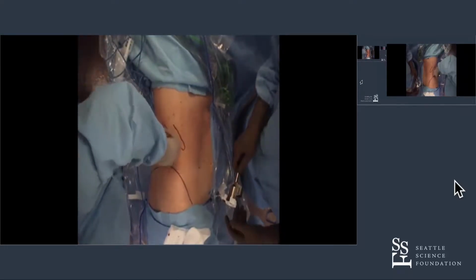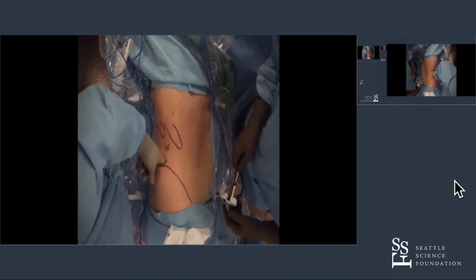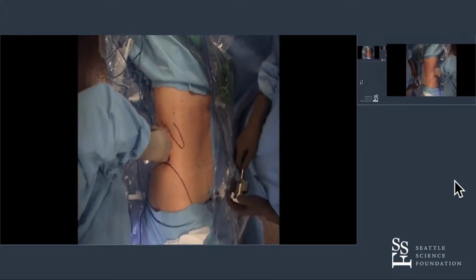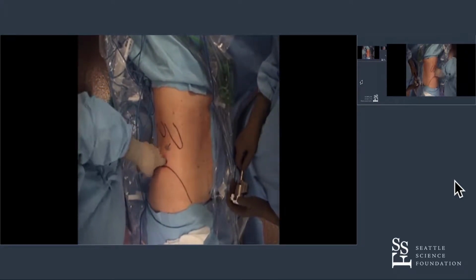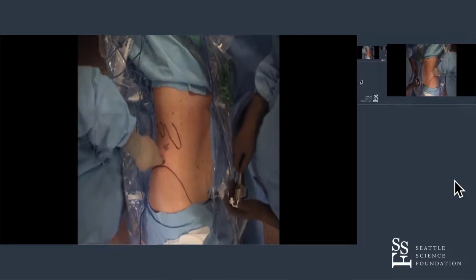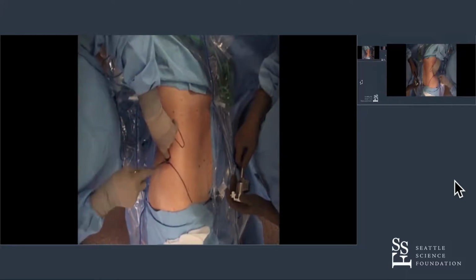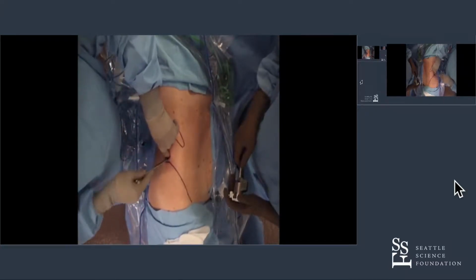So he's popping through with the tonsil, and then he's going to stick his finger down there. And usually there's more than one layer. You want to get all the way down until you feel that loose fat. It's like fat that just gives. There's like no fibrous nothing to it. It should really feel like just fat. Otherwise, you're not in yet. So keep going down there. And then once he gets in the space, he's going to put his balloon dilator in.